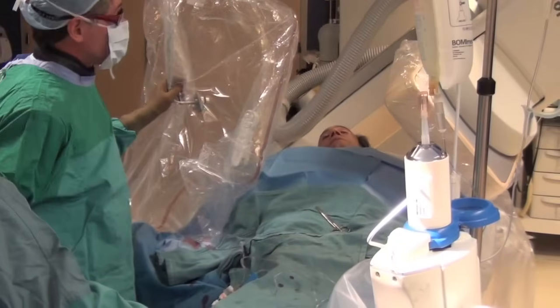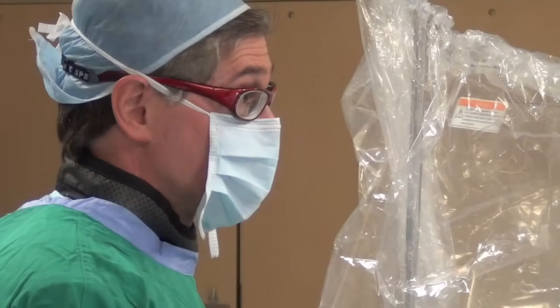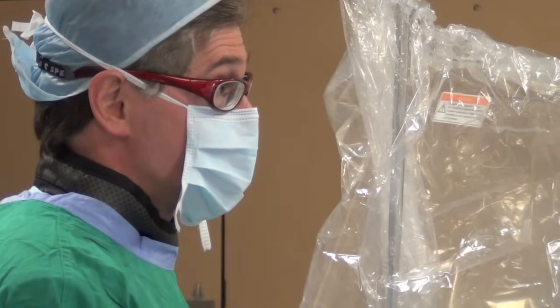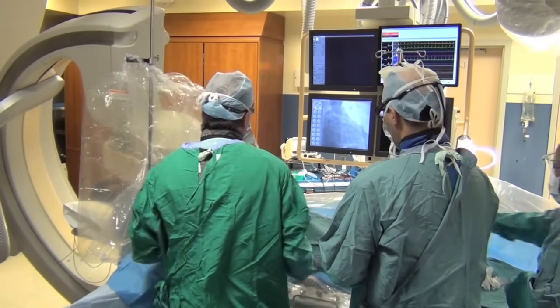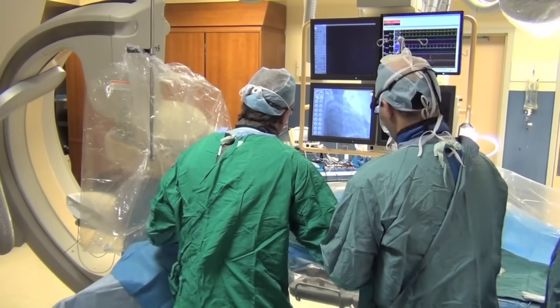We take multiple pictures from different angles — that's why you see the camera being moved around to different projections. Once we've seen the images, sometimes we will proceed with the angioplasty procedure, that's the balloon and stent, right then and there at the same time. In other situations, it requires further discussion and thinking about it, and possibly other types of treatment.